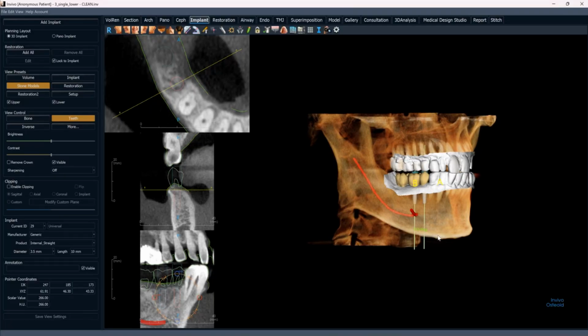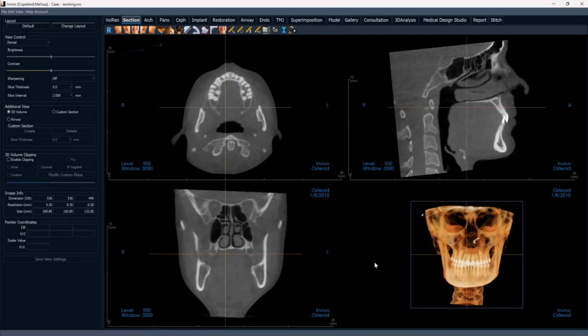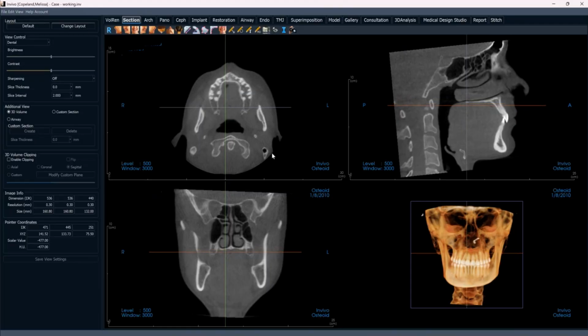Now, another commonly used workflow that we see our software utilize in, just to give us that quick overview of feature functionality, is that orthodontic space. So I do have another case for us here that I can pull up real fast. Now, in addition to our more commonly seen section tab, which is like that home page to a 3D image, where we can see our cross-sectional views, axial, sagittal, coronal, adjust our orientation for the patient to align things really nicely before we jump into other tabs.